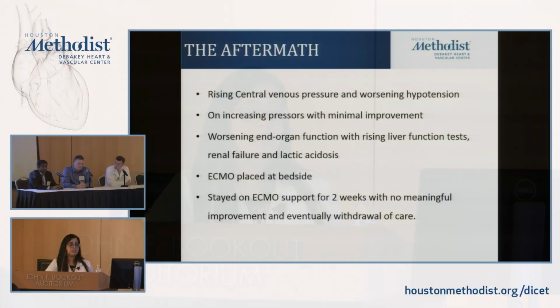The other major issue with her was that she had complete obstruction of her IJs, so we couldn't do a PROTEK Duo in the cath lab anyways, but we could have considered an RP IMPELLA, but her Swan was in her groin as well as the balloon pump, and the other new CP IMPELLA was on her left groin. So that was kind of what also swayed the decision, but she unfortunately didn't do well.